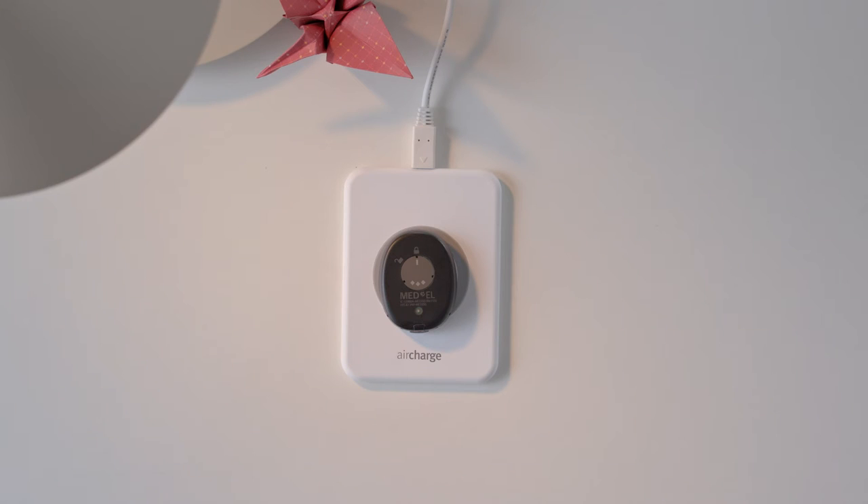When the light goes off, RONDO 3 is fully charged. This should take 2.5 to 4 hours. We recommend charging your RONDO 3 overnight for a full day of hearing.